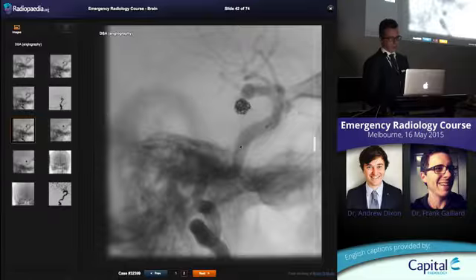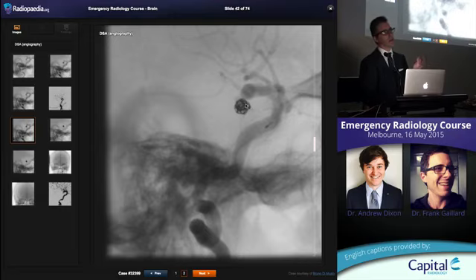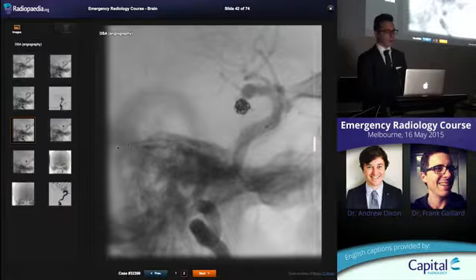So a microcatheter, you can see the point of the microcatheter here, has been advanced up the internal. This is at the end, so it was actually in here. And the aneurysm is filled with what are called coils, which are small platinum or metallic wires that form a ball, and blood clots around them, and eventually that endothelializes. Much nicer than having a craniotomy. But some aneurysms aren't amenable to endovascular treatment.